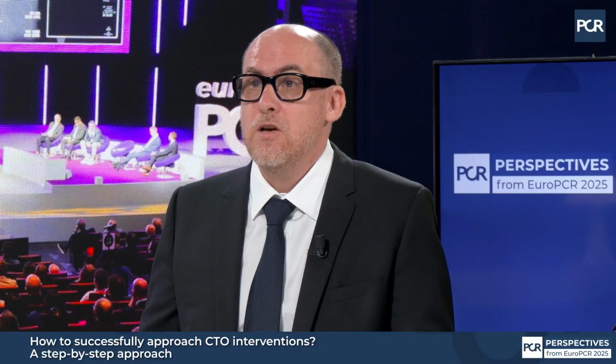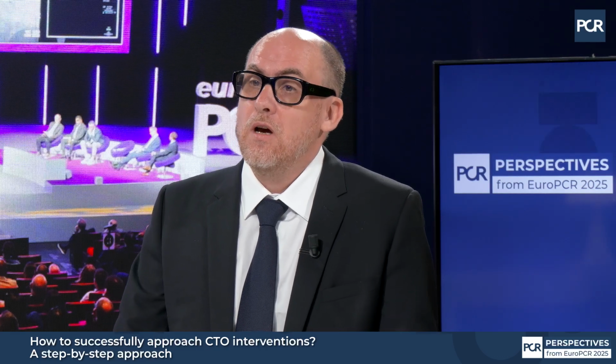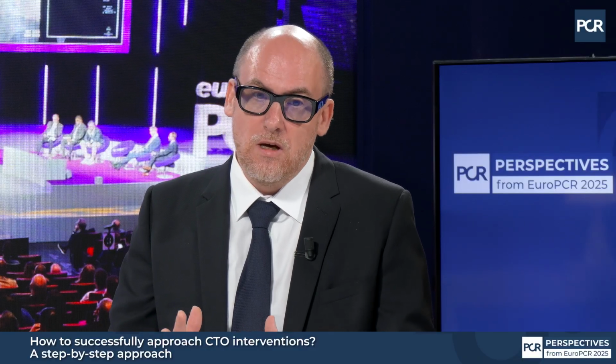But we know that CTOs, difficult CTOs, can be very complex. The success rate is very good now in a large center with good experience, above 90%, but it's not 100%. You have to tell the patient if you did not succeed. Maybe we can retry it, because generally when performing a CTO, you are with a dual injection, with all you've done, you understood things that can help for a future success. But failing, even if we want to succeed all the time, failing is not a big deal if there is no complication. Yeah, so failure without complication is far better than a partial success with a big complication.